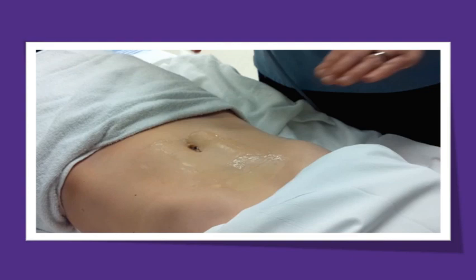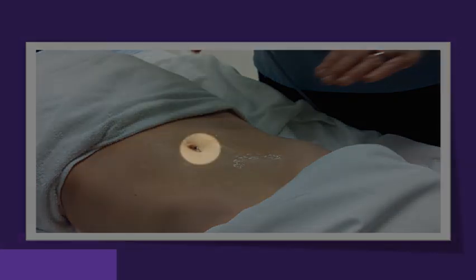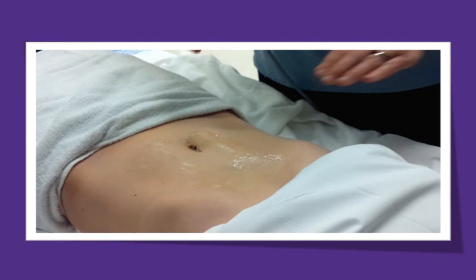The majority of aortas you will scan will bifurcate at or near the patient's umbilicus. The umbilicus is an air-filled structure, and as such, scatter may make your assessment difficult. We may also encounter foreign bodies such as piercings, as we demonstrate in this model patient. One option is to fill the umbilicus with gel to remove the majority of the air pocket, although to be honest, this is not a technique I use frequently.